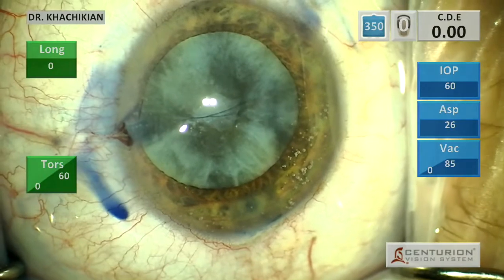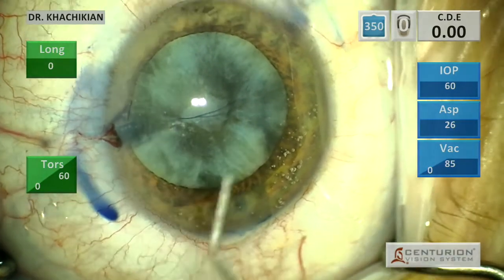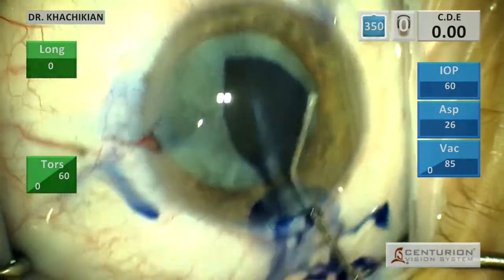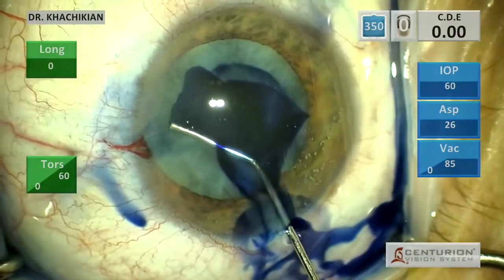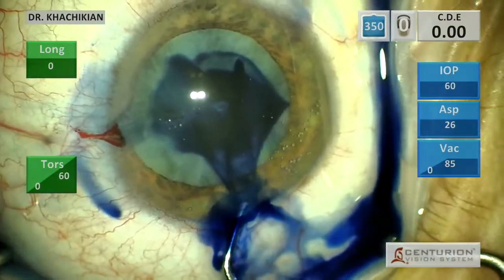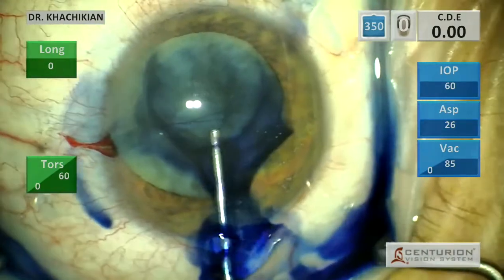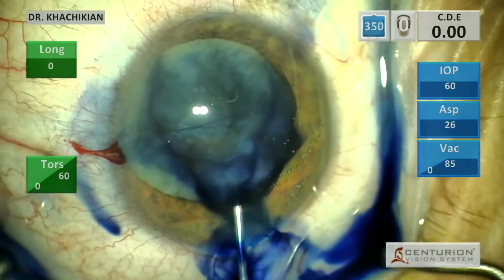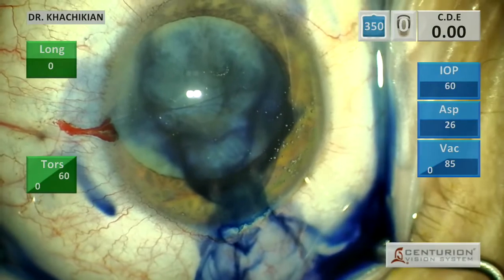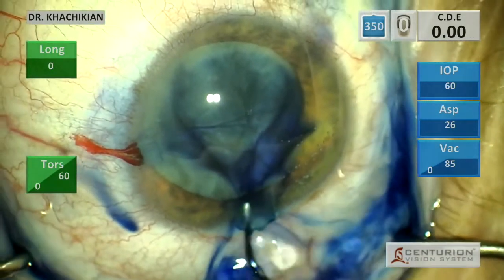I could tell this is going to be a fairly difficult case with a lot of extensive nucleus disassembly, and so I wanted to be very clear about where the edge of the capsule was throughout the entire case. It is also likely to be a longer case, and over longer cases the TriPan Blue on the anterior capsule can fade, making it difficult to see the anterior capsule. So I wound up staining again under viscoelastic, which gives a darker stain.